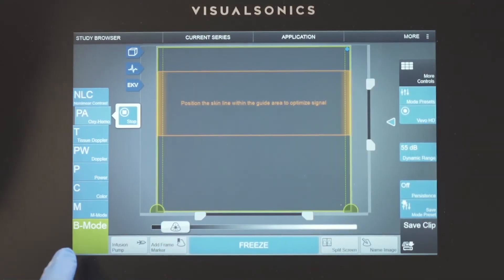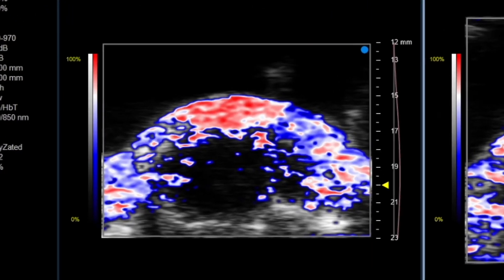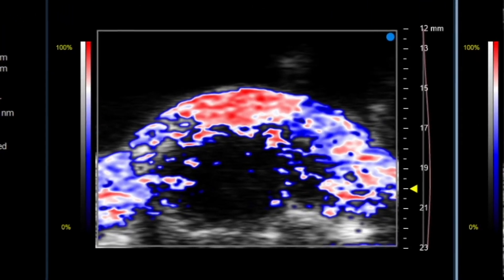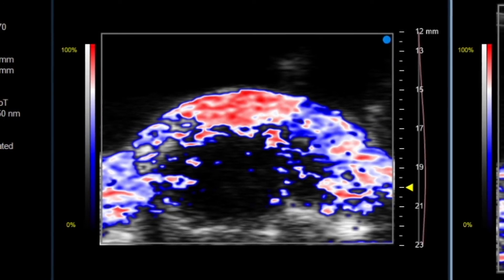In photoacoustic mode, this image of a mouse brain shows you the result using the wide fiber. We have a limited depth, but a wide field of view. This configuration is well suited to large superficial anatomical targets.